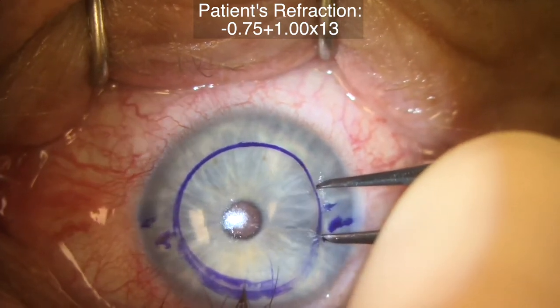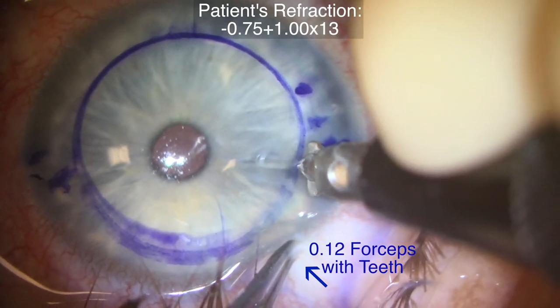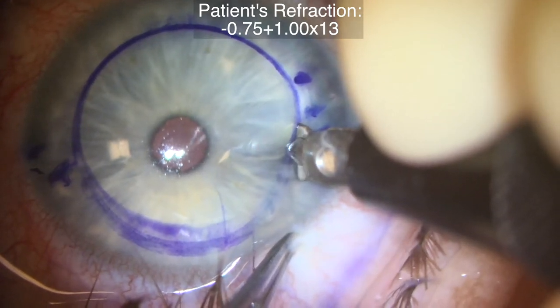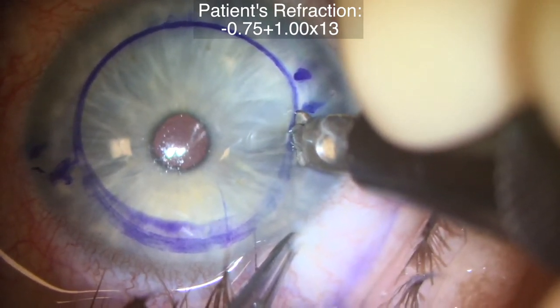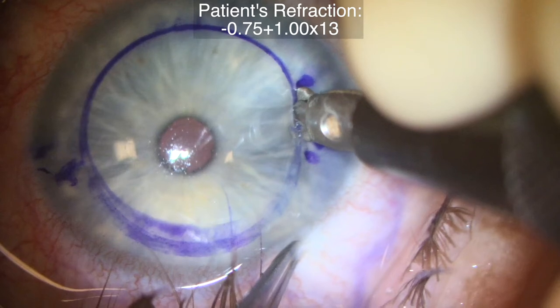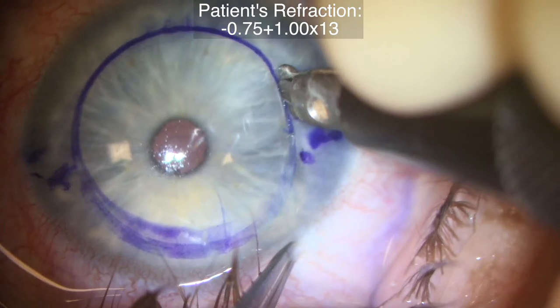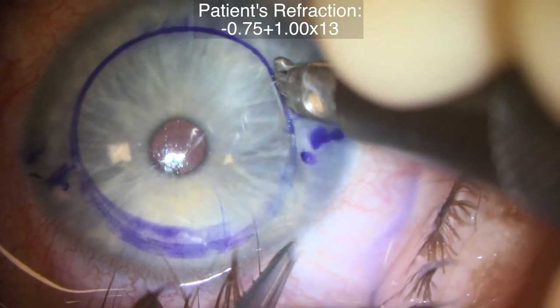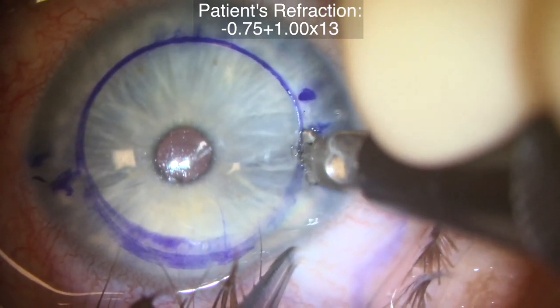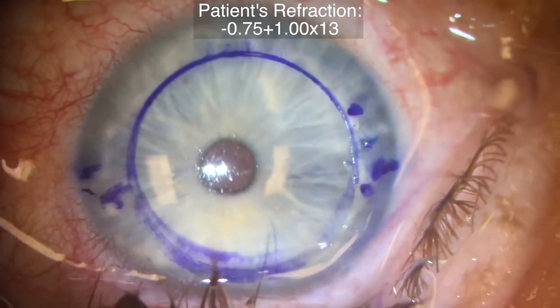A few surgical pearls. Stabilize the eye with 0.12 forceps with teeth to provide countertraction and prevent torque of the eye from the diamond blade. We either move the diamond away or toward the 0.12 forceps with teeth. Also, stabilize the hand with the 600 micron guarded diamond on the patient's face or cheek so that the diamond will move in sync with the patient if the patient moves suddenly. The incision usually takes about 5 to 10 seconds. We usually make one pass and then a pass in the opposite direction to make sure the incision is at the full depth of the diamond blade, set at 600 microns.